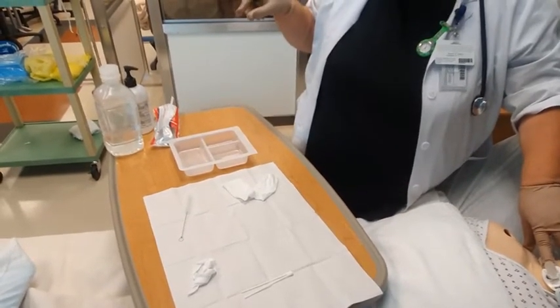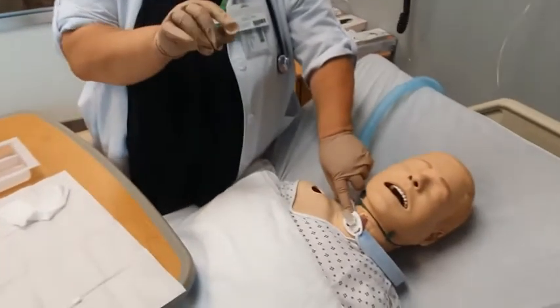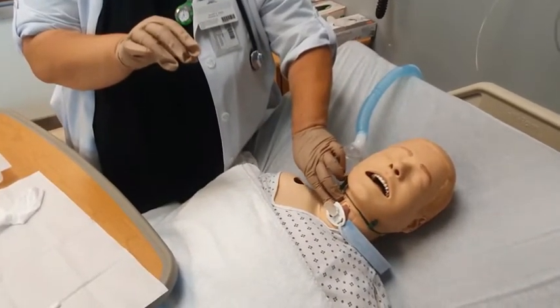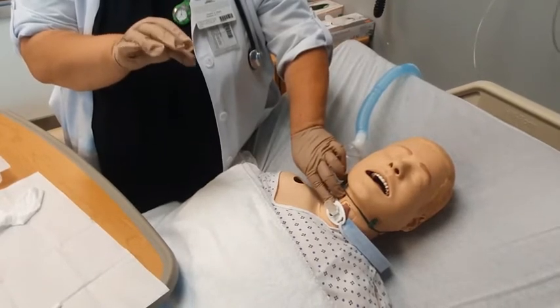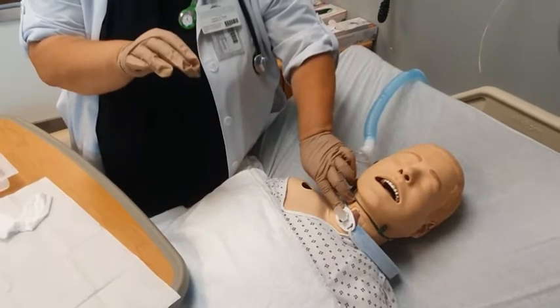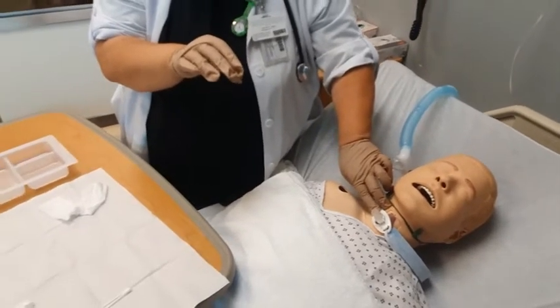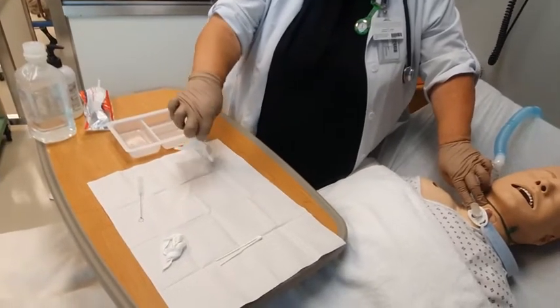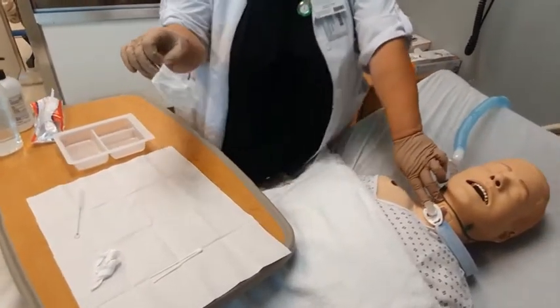Inspect the stoma and the surrounding skin. So what you're doing is you're looking at the skin to make sure that the stoma is pink, no drainage. But if it's having drainage, you would document that. Or if it's swollen or a lot of crusting and everything around it, you would document those. And at this time, apply pre-cut, non-raveling trach dressing under the faceplate of the trach tube. And do not ever cut a 4x4 for the dressing.